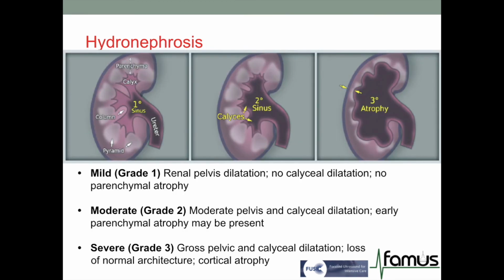With regard to the degree of hydronephrosis, the hydronephrosis is... no, okay, again, number 18.